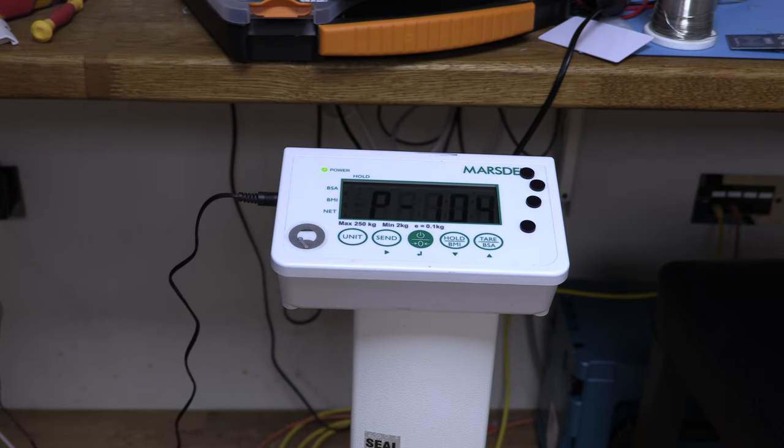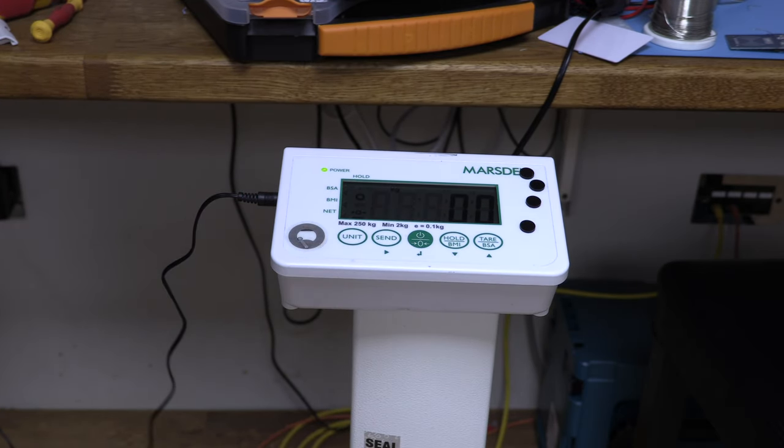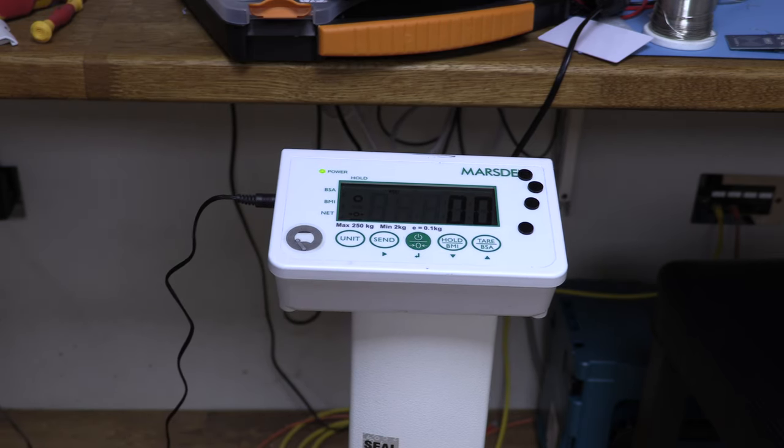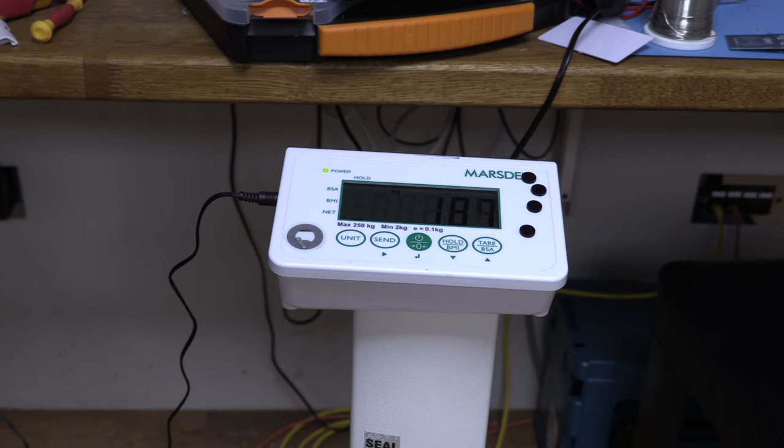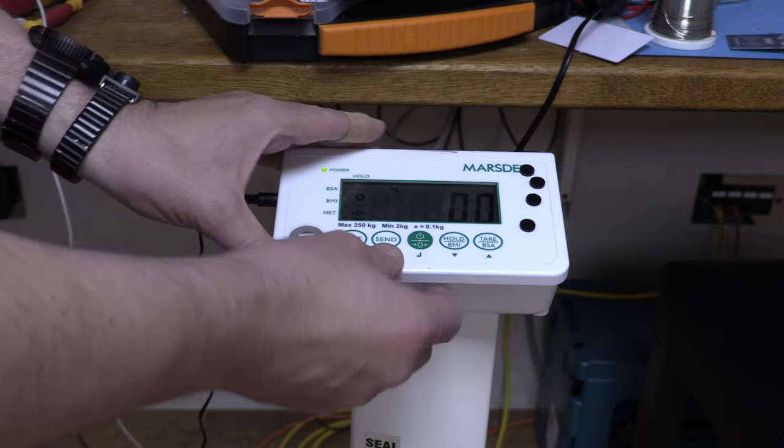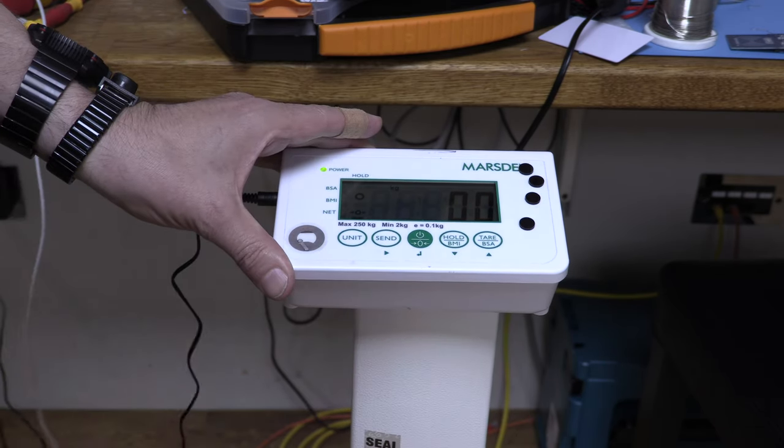It's looking good. Okay so it's reading zero and if I put my foot on it it's showing weight.